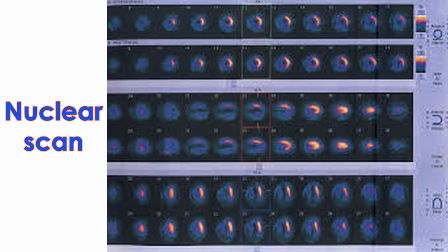If there is already significant damage to the myocardium, a nuclear stress test will also give an indication on whether the damage is reversible if the blood vessels are opened up with a procedure. The procedure could be either coronary angioplasty or coronary artery bypass surgery. This is known as myocardial viability assessment.